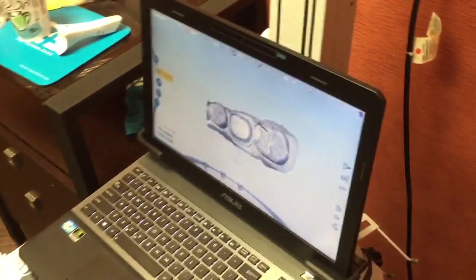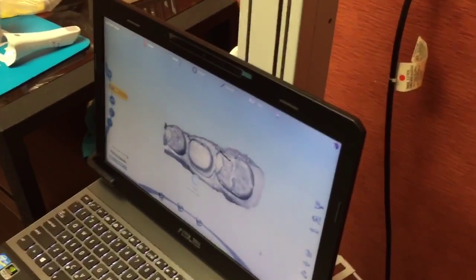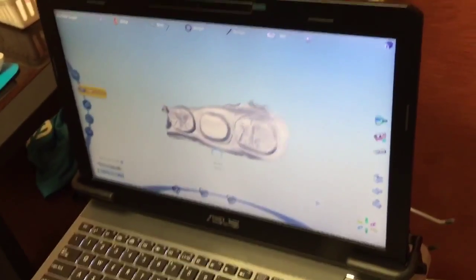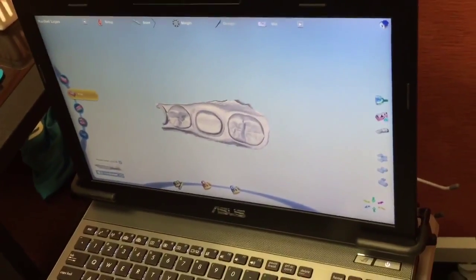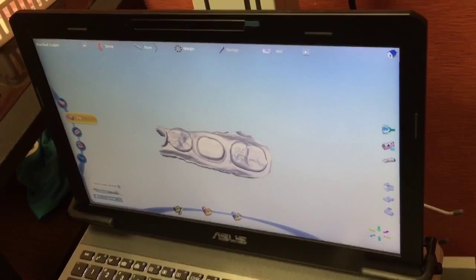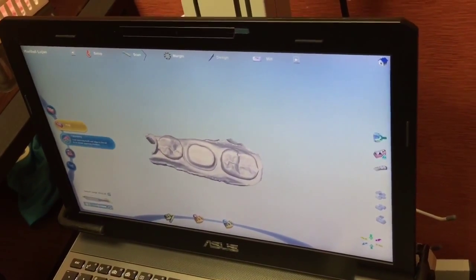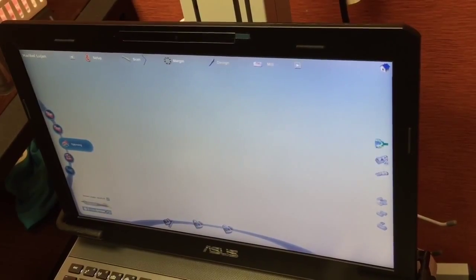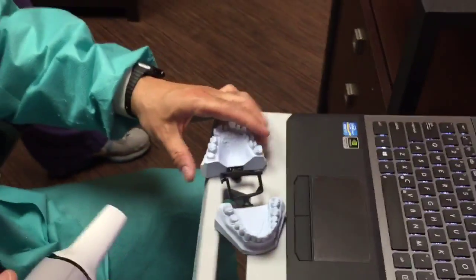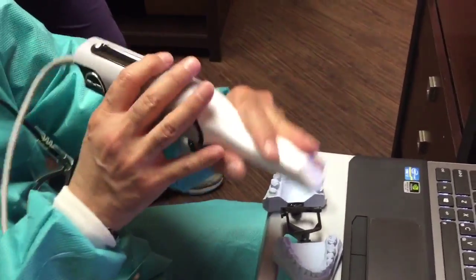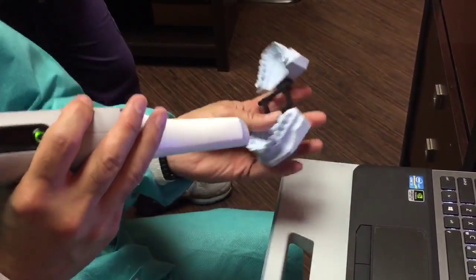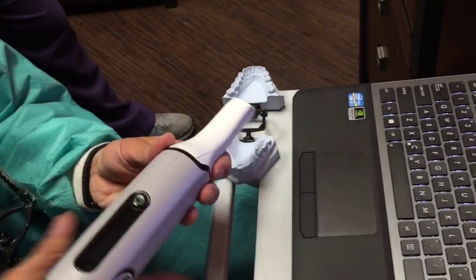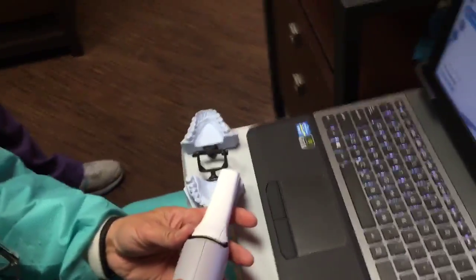Generate model. See, I have a lot of excess data here. That's why I got all the scratches. Now you got a nice model. Now, I got to go to the opposing tooth. So what I told them, Heather, when you start scanning, you always start from the distal. Now the opposing in this kit is number 31. So I don't go like this. The tip always starts from the distal. So the patient is laying down, upside down. So you start on number, I'm going to get three, four, and five. So you press it on the number three.